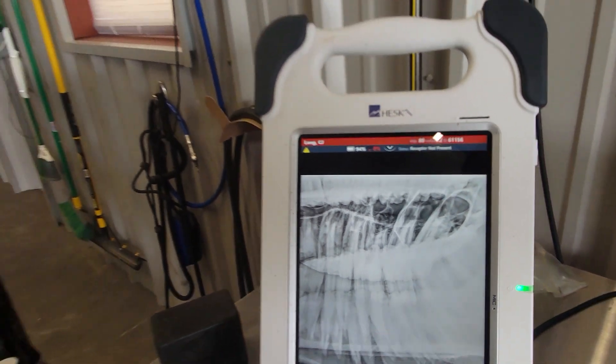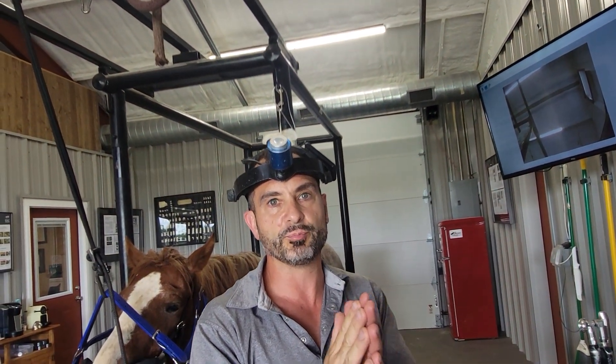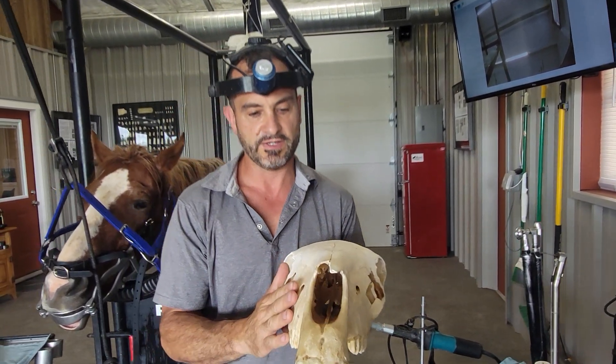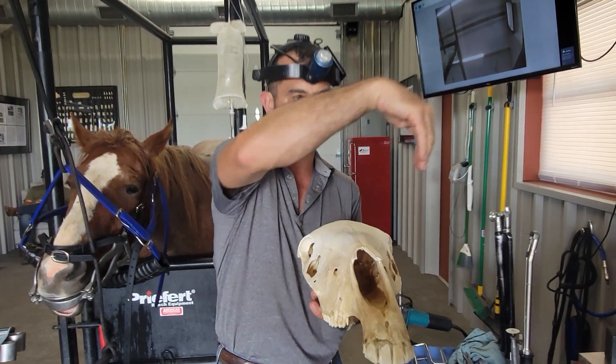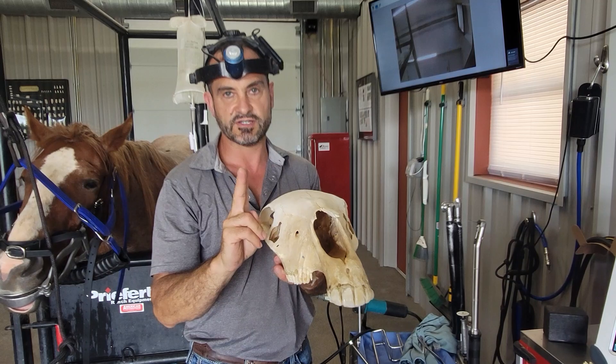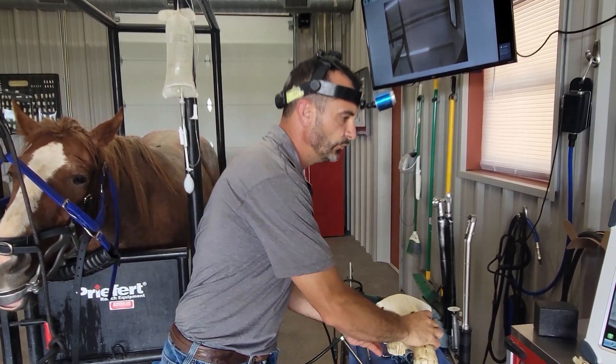That actually makes sense because the palatal root is the one that tends to communicate more with pulps 3, 4, and 5, which is what we saw on the oral exam. So don't be fooled by doing a lateral oblique radiograph, which is the most common view. On the 109, the cassette would be here and the generator would be coming from this side — that highlights the two buccal roots.